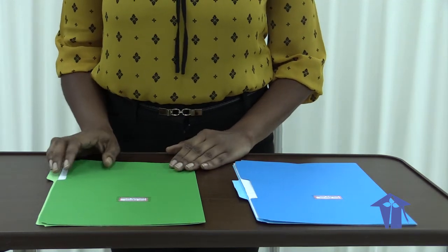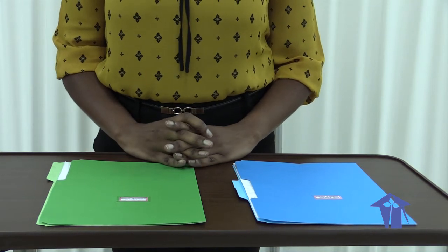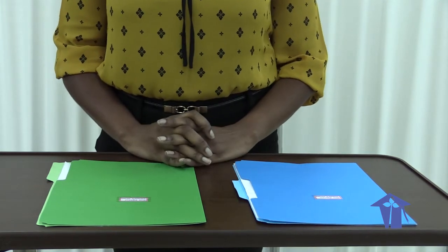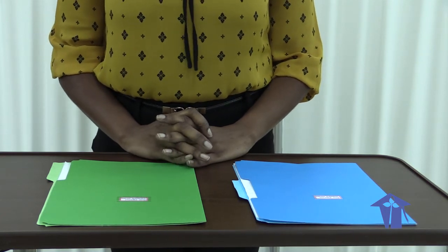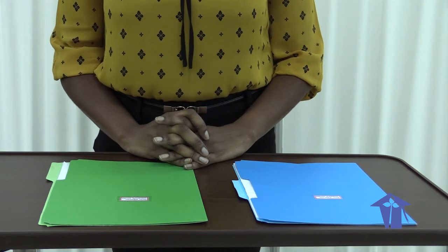Today we will be demonstrating the wound care procedure. Your first step is to check your doctor's notes, and you will be looking for your doctor's orders with regards to the patient's wound. You need to ascertain the dressing material which will be used for the wound.